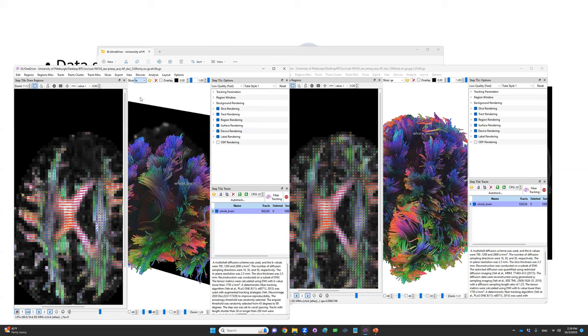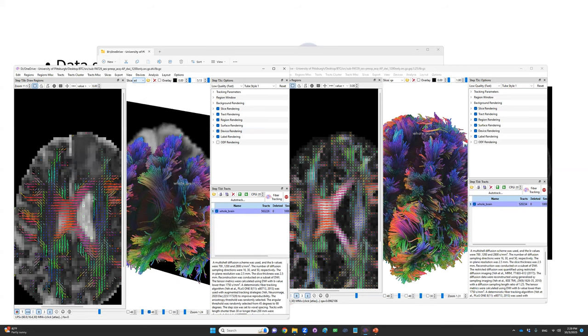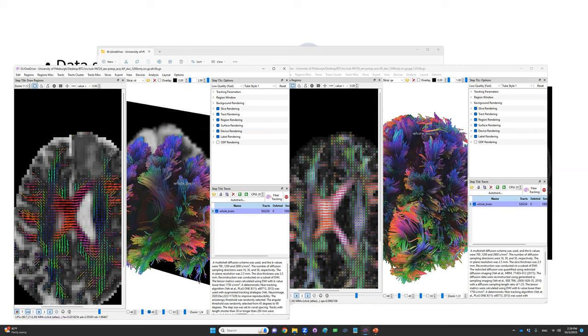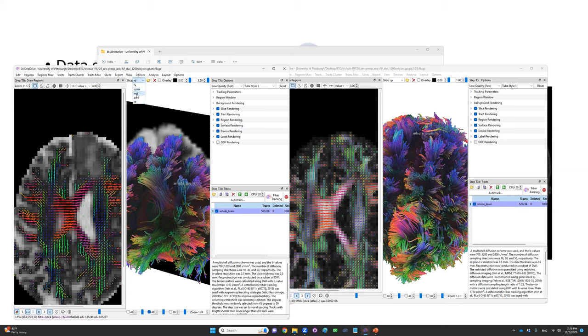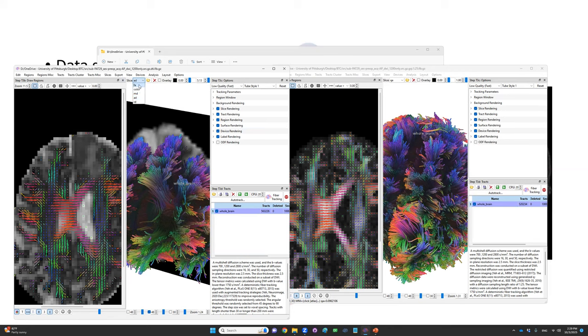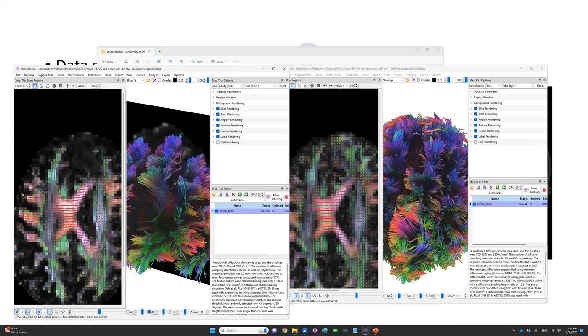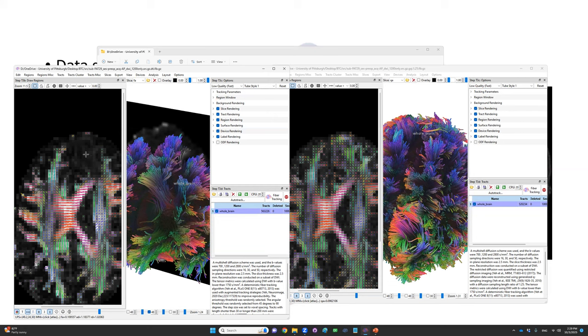If you look at the axial-diffusivity map, there will be slightly hyper-intensity regions due to peritumor edema. Also for radial-diffusivity, there's hyper-intensity region due to peritumor edema. If axial-diffusivity and radial-diffusivity are both higher, then FA drops substantially. It's not due to fiber being destroyed, it's due to peritumor edema. Tensor model has a hard time differentiating that. As a consequence, fiber tractography based on DTI model gives you an empty region.